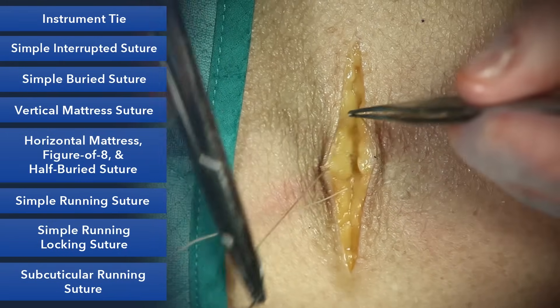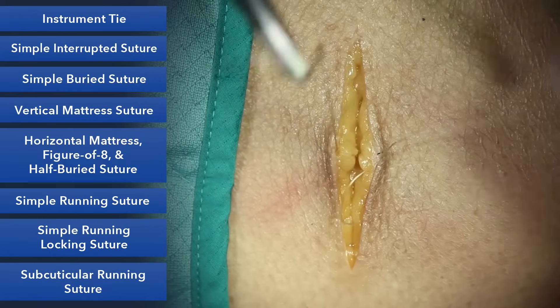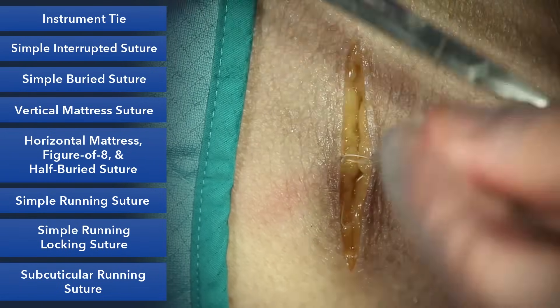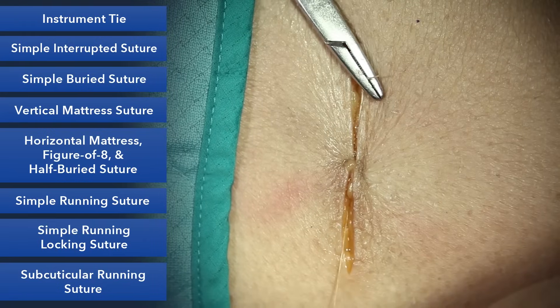You can see here's my loop and here's the suture coming out from the same side. As we tie this down, we'll do an instrument tie and pull it along the length of the wound, which will help the skin edges come together.